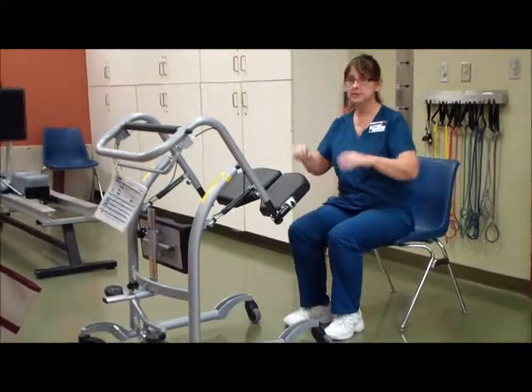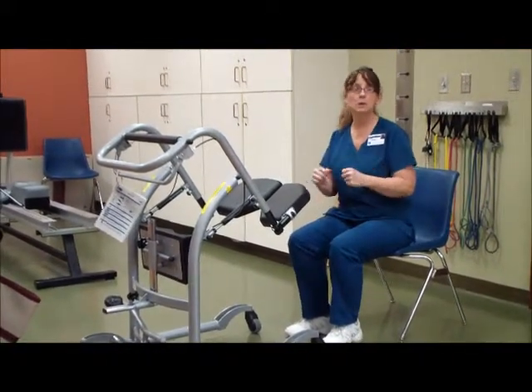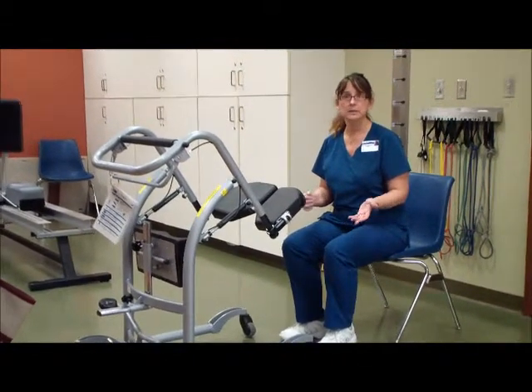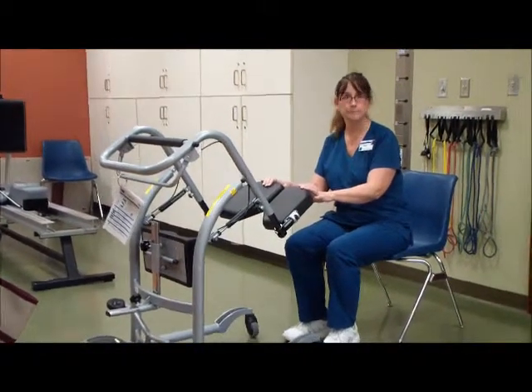So the patient's got to have some strength, but they may have low endurance, where they're walking along and then they get tired and they need to sit. But it's folks that are more on the independent side with using this.